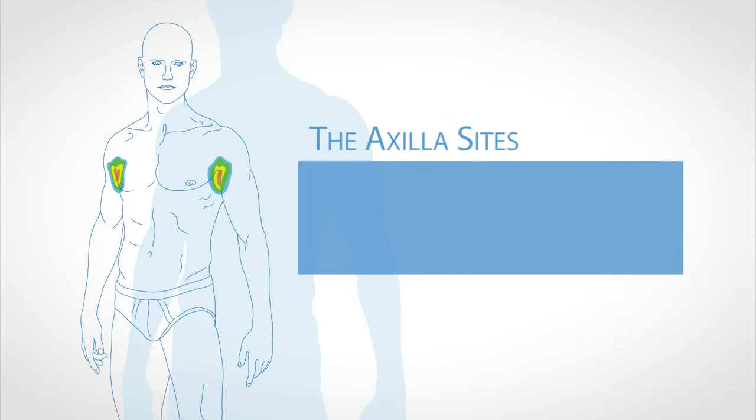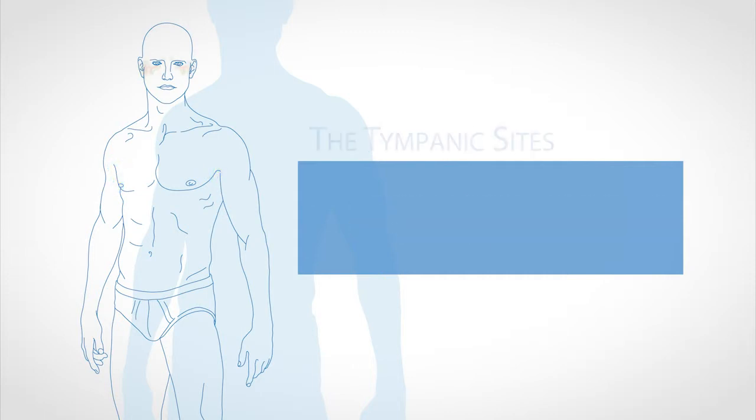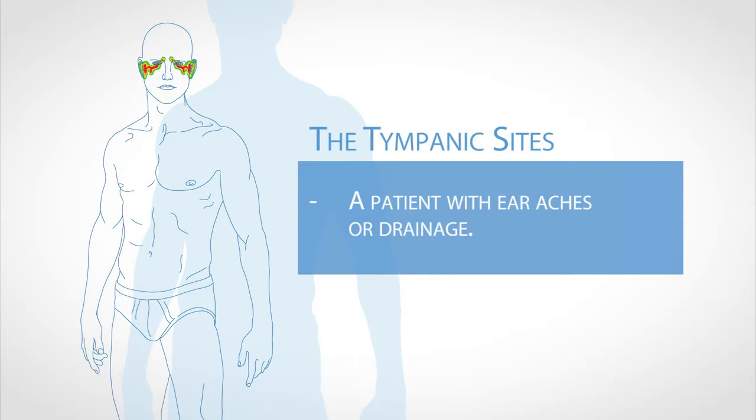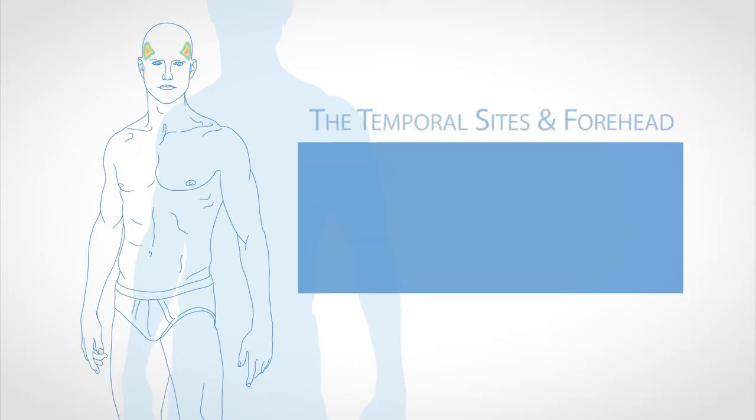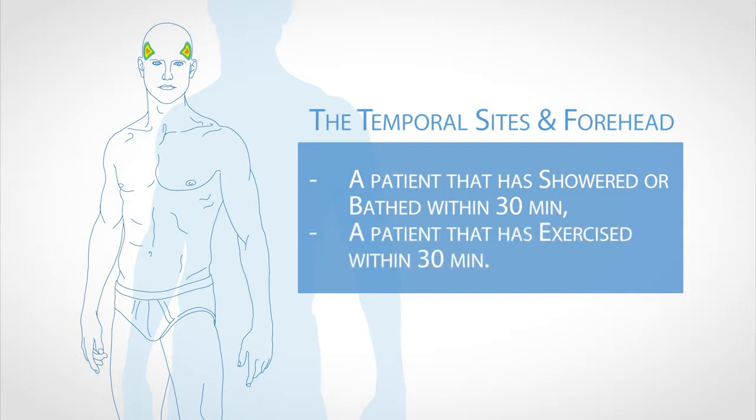The axilla sites, a patient that has showered or bathed within 30 minutes. The tympanic sites, a patient with ear aches or drainage. The temporal sites and forehead, a patient that has showered or bathed within 30 minutes. A patient that has exercised within 30 minutes.